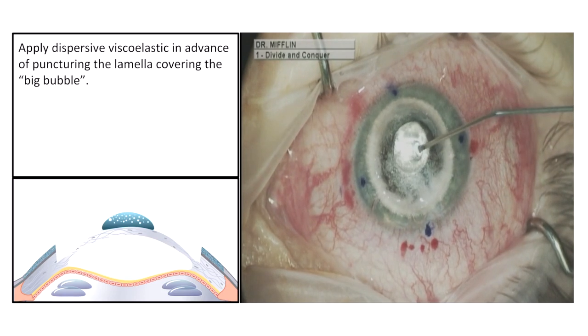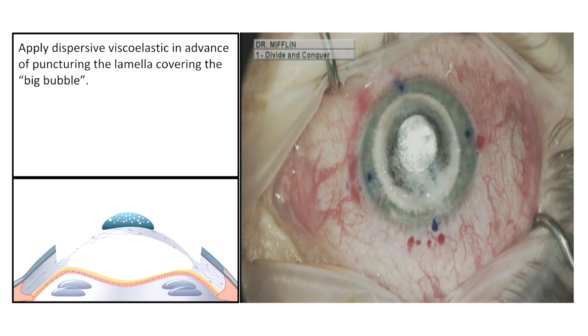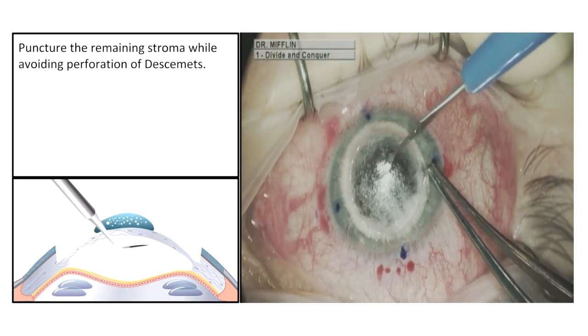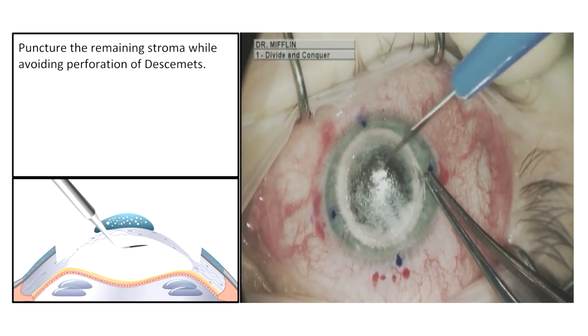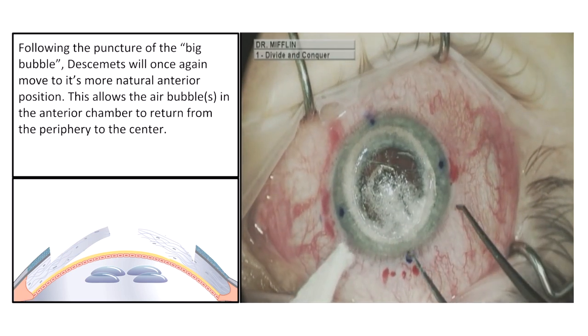Then apply dispersive viscoelastic in advance of puncturing the lamella covering the big bubble. Puncture the remaining stroma while avoiding perforation of Descemet's membrane.